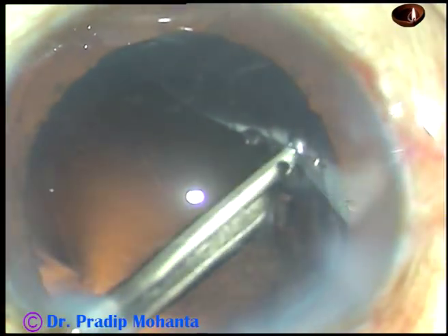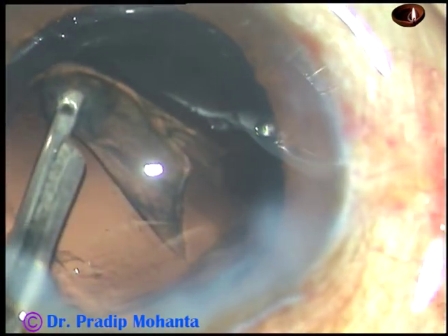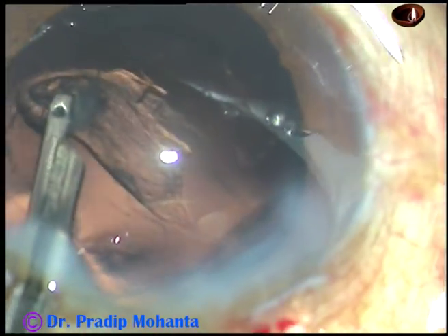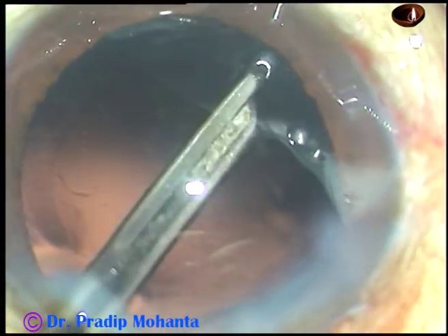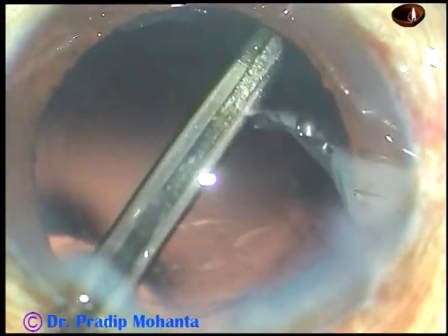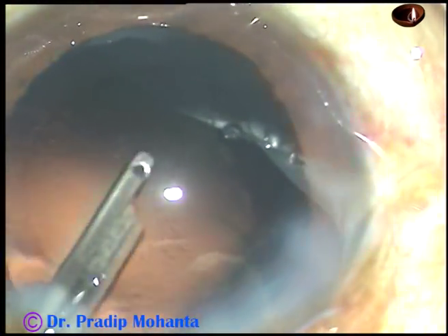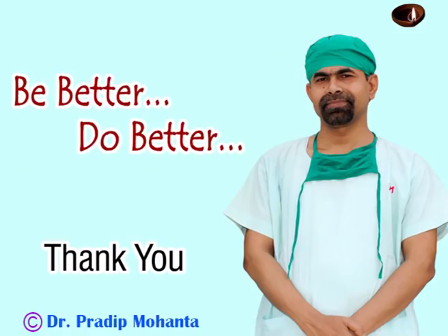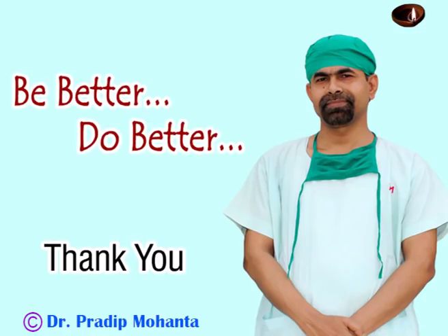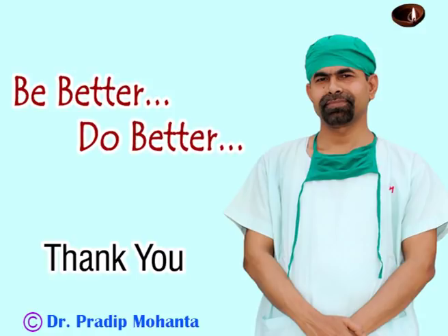This is a long case, so in this video I am going to conclude after cortical aspiration. This will be followed by another video in which I will show implantation of the intraocular lens and how I managed further complications. Thank you very much for watching — hope this video will help you in developing your surgical skills.